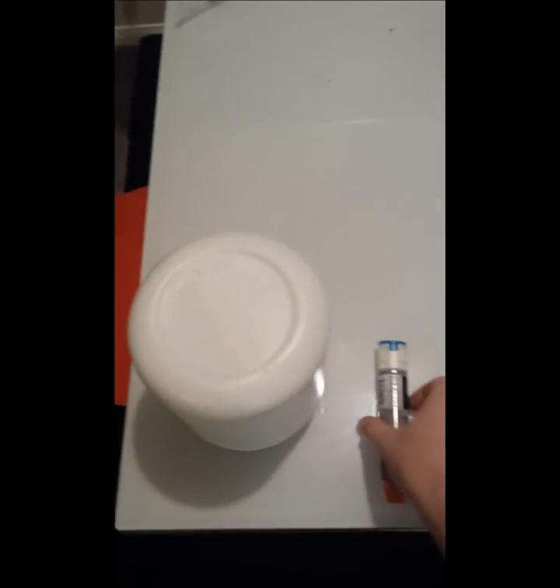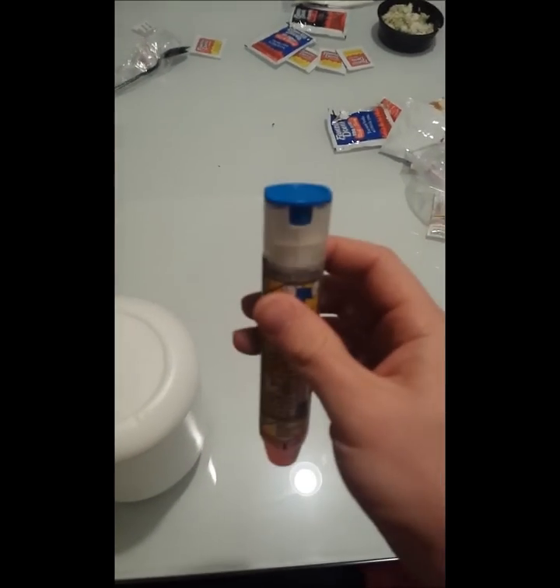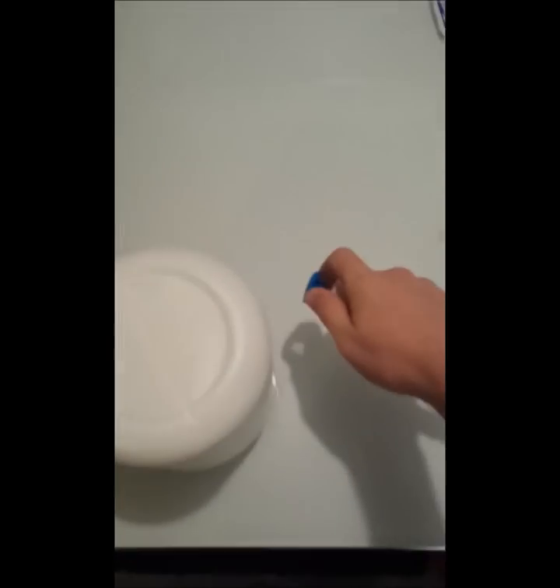This is an expired EpiPen — it's been sitting around for a while, you can see it's June of 2012. If you're going to use the EpiPen, what you do is you take the blue cap and just take it off of the top here. There we go.